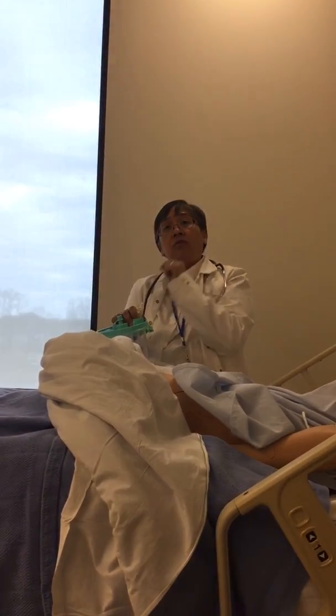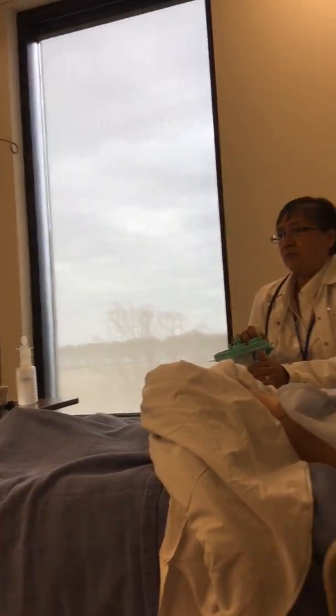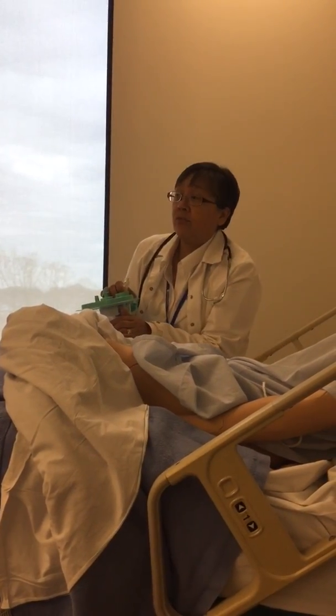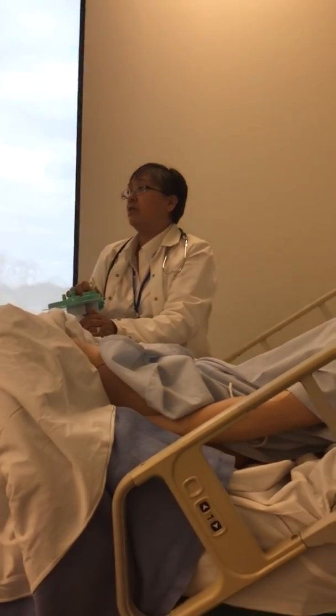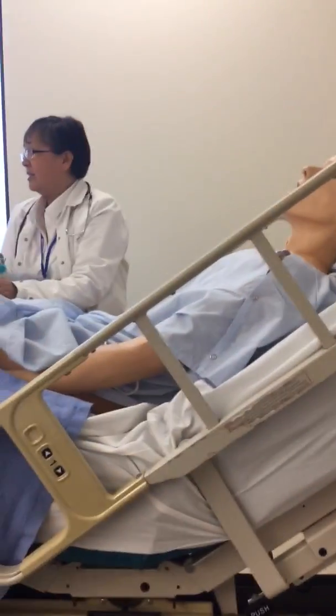So if I check for residual and I got a lot, because on one of those numbers there it talks about a residual of 100 or 200 cc's. Can you see that? The number maybe 19 or 20 somewhere down. Okay, so if it's over 200 cc's of residual, we're not going to give this medication because it's not going to be digested. There's something wrong with this.